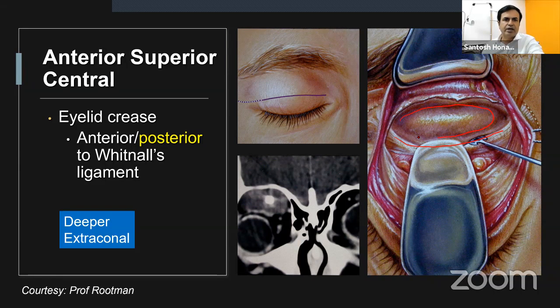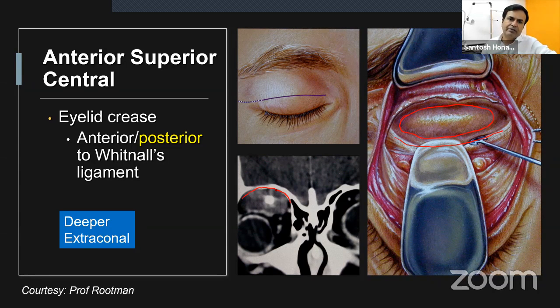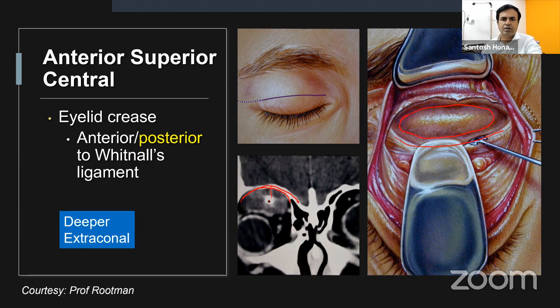An incision through the Whitnall's ligament is rarely used, as it causes ptosis. A safer sub-brow incision bypasses the levator. Alternatively, with the lid crease approach, go all the way to the superior orbital margin, incise the periosteum, and come that way, bypassing the levator muscle altogether. The sub-brow approach is also a very nice incision for lesions that are immediately subperiosteal or extra-periosteal.